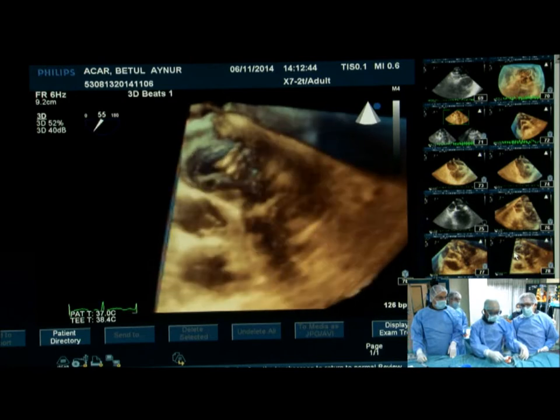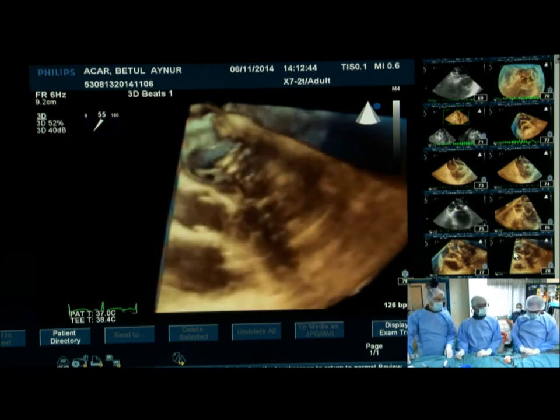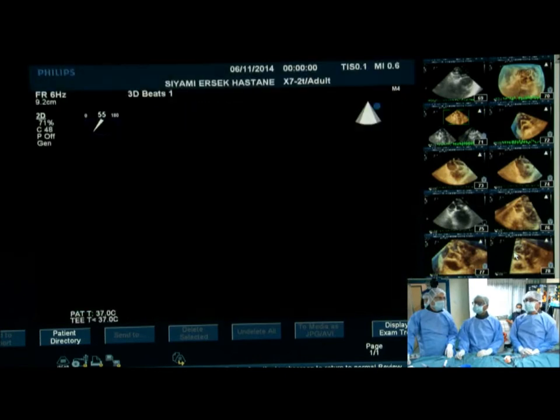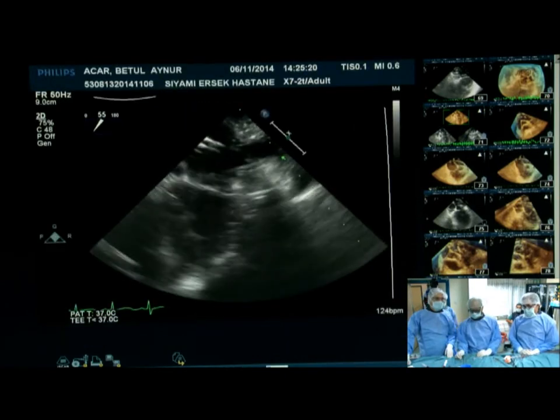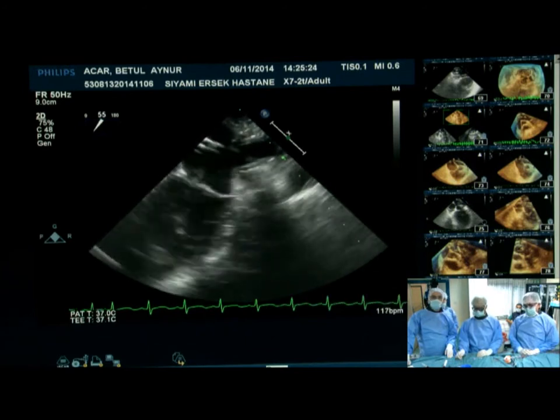18 or 20? And which device? You can use... What's that? A normal ASD device, I would put this case. Not 18 you're suggesting, yes, okay. Yeah. Any other suggestions? Cribriform.